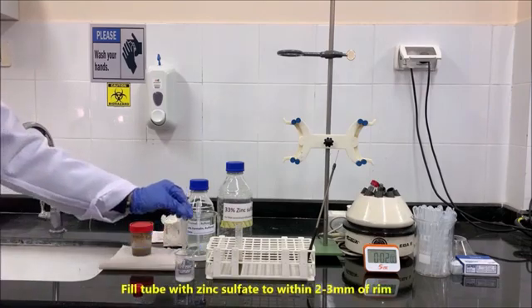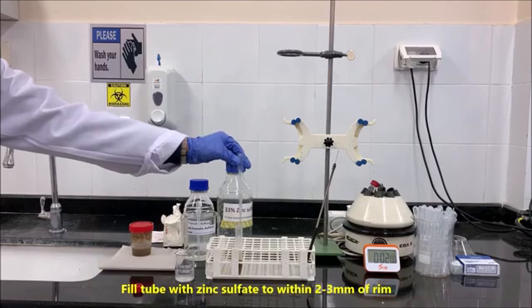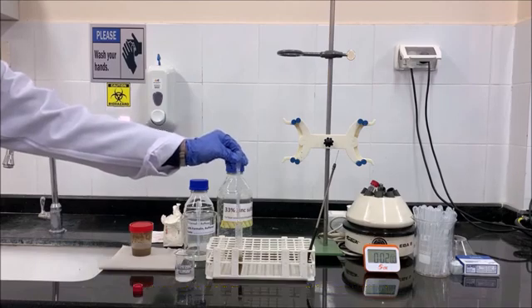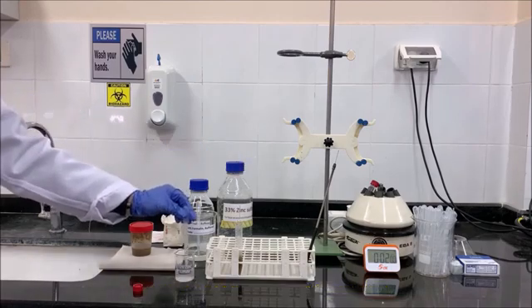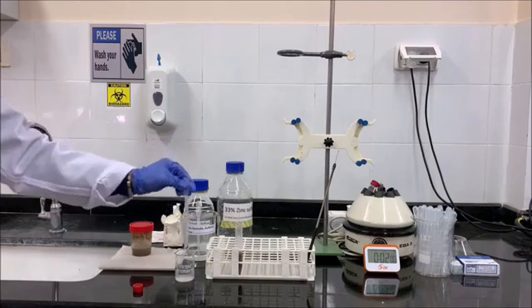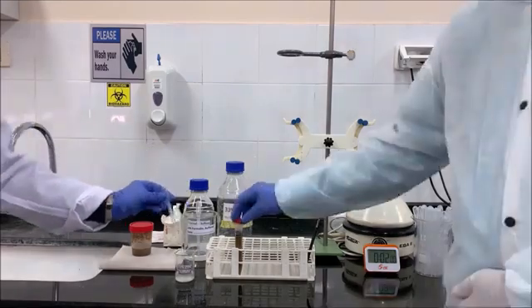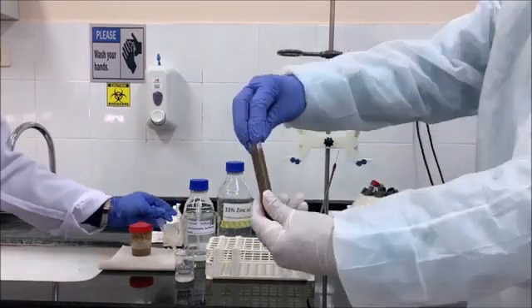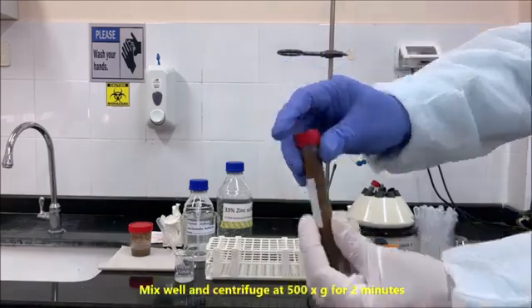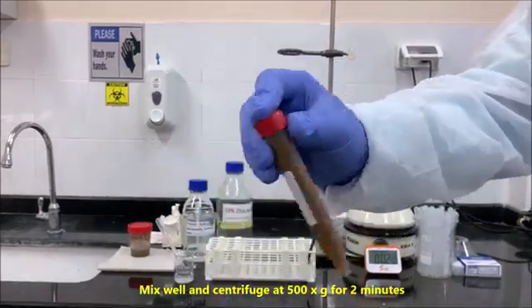Fill tube with zinc sulfate to within 2 to 3 millimeters of the rim. Mix well and centrifuge at 500 G for 2 minutes.